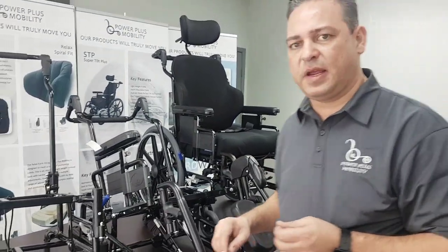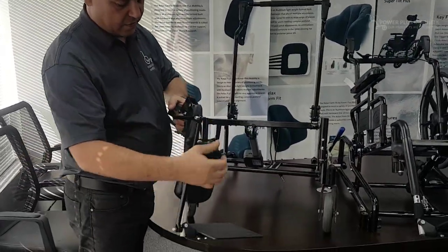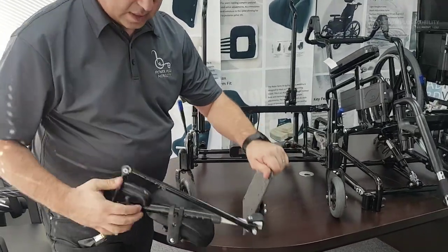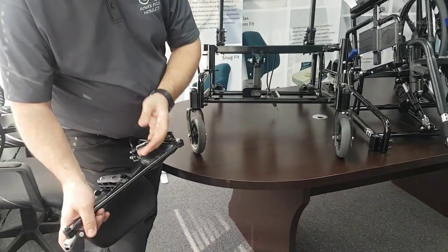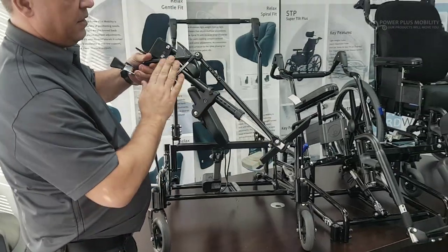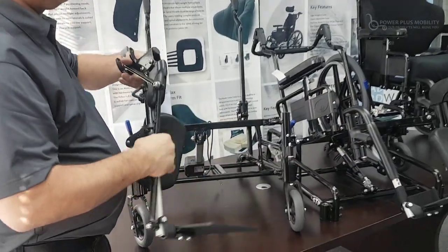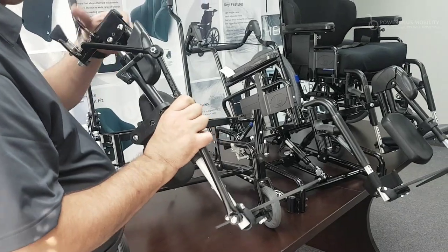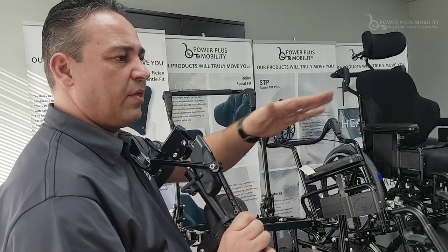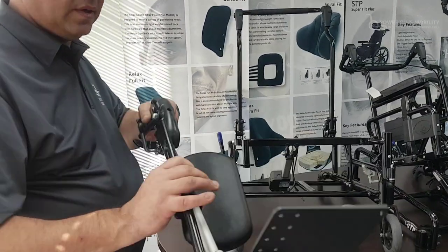We also have another type of front rigging called an elevating articulating front rigging. As I elevate this front rigging, you'll notice it extends outward with your leg. For somebody who is not in a fixed position and has flexibility within their knee, when we elevate it hits their leg and it elevates with them, without pulling their knee into their chest. This is a very popular device and is fully functional.